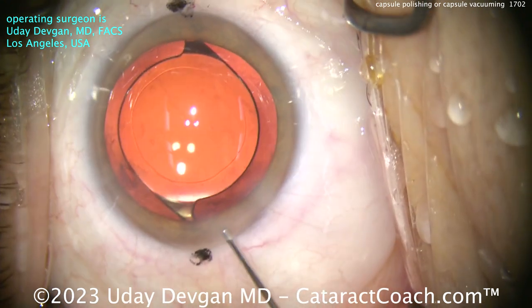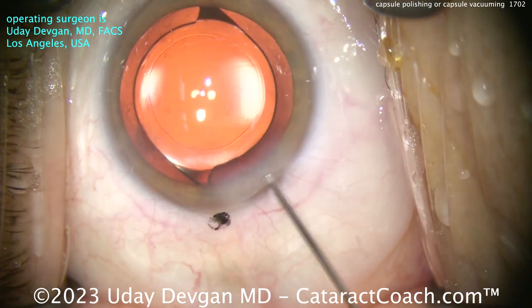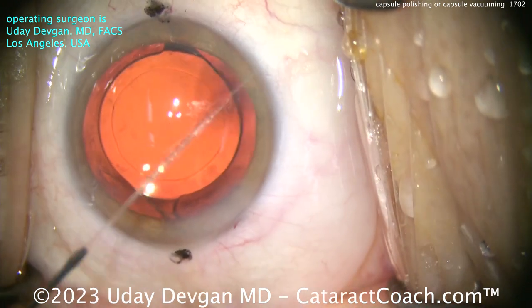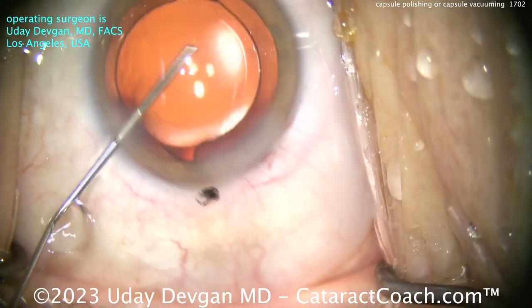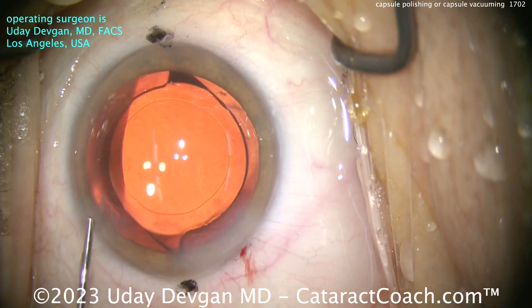So here we'll seal up the incision — end of the case. I want to show you one more video clip coming up. Nothing is 100% safe, by the way. I'm pretty happy with that rhexis overlap — that looks like a nice case. If that's my signature, I'm a very happy man.